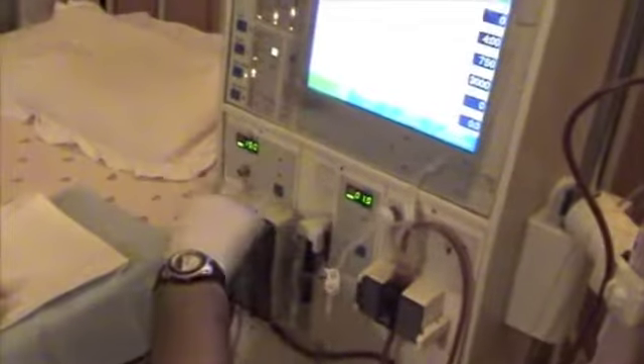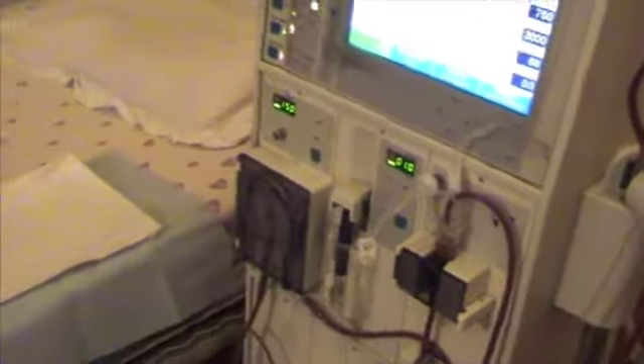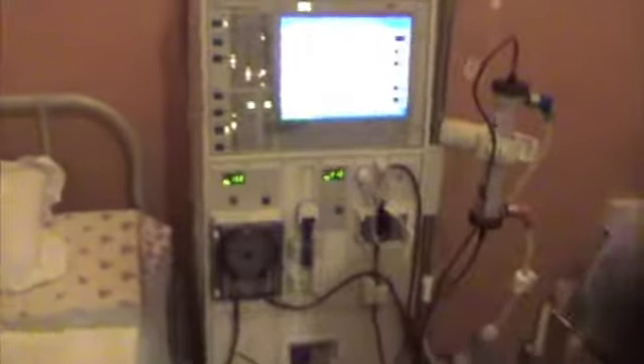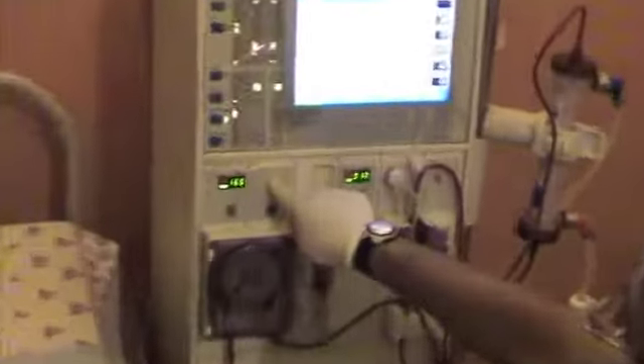Open the clamps. Now increase the pump speed to about 200.